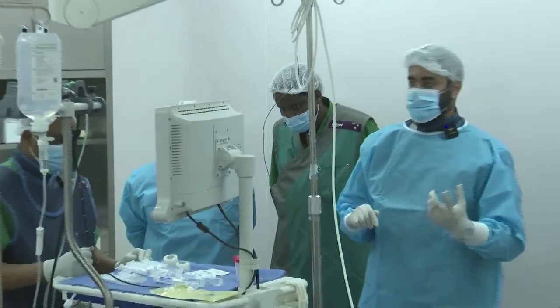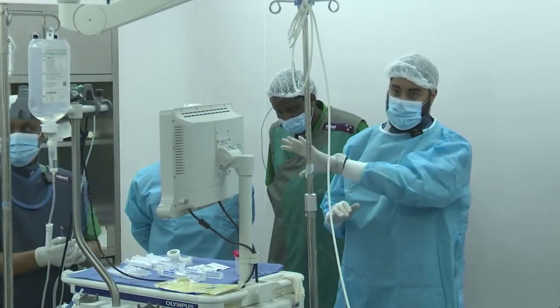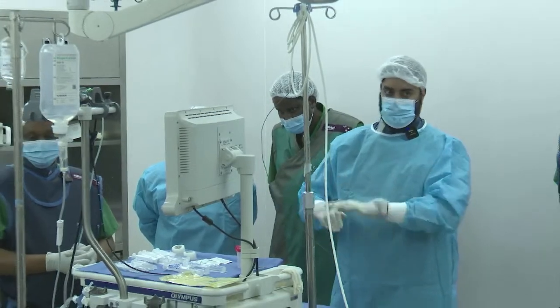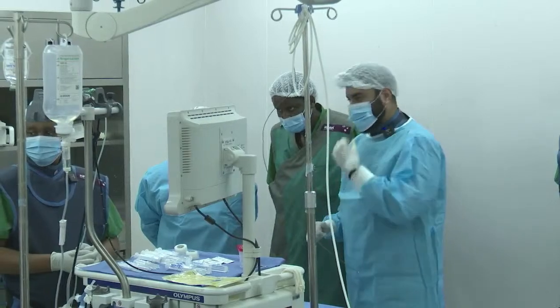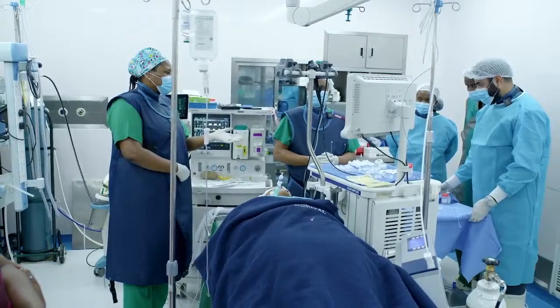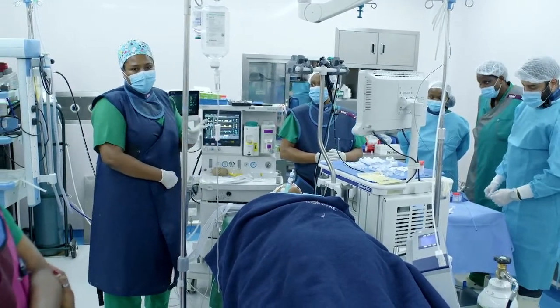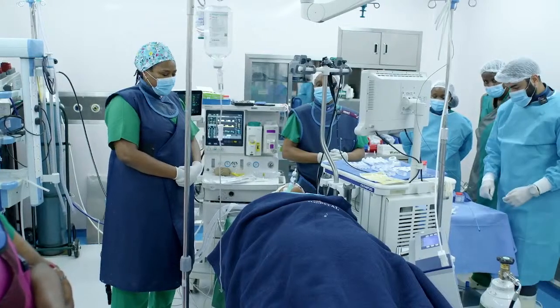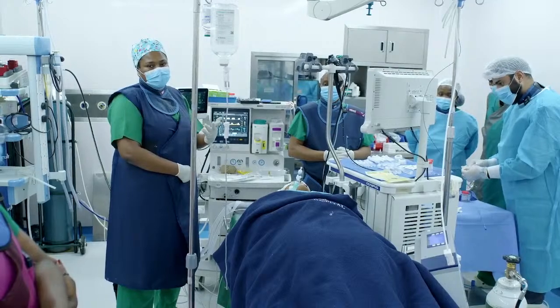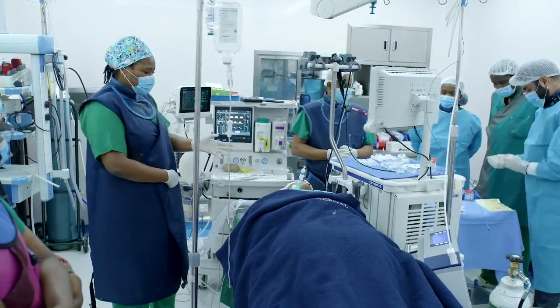But last thing I'll say is anesthetic considerations. Dr. Gitau, she's done a couple of cryos now with us. So, what's the anesthetic angle on this? Because it's a shared airway, first it has to be the appropriate patient. Make sure that the patient, in terms of intubation and airway management, is okay. So in terms of the airway management, it's completely straightforward for intubation.